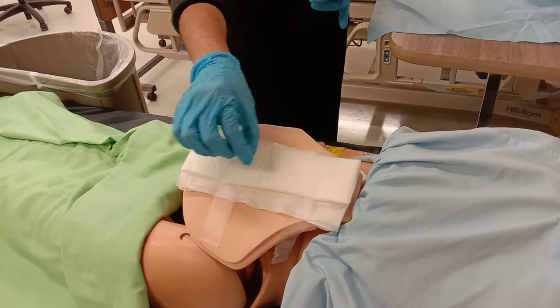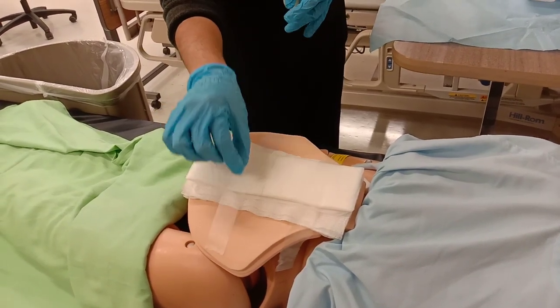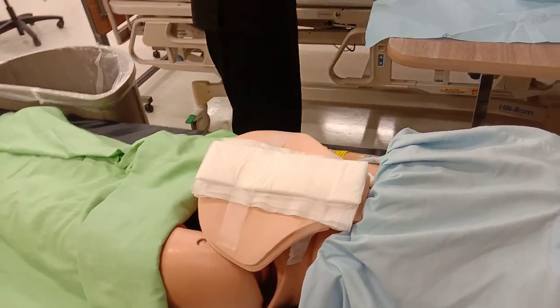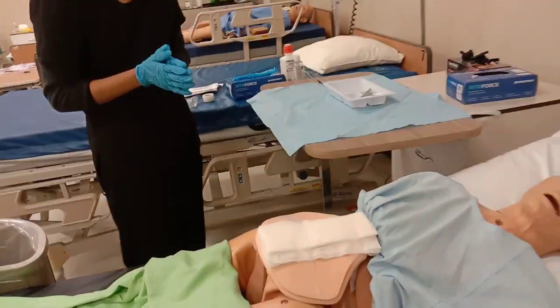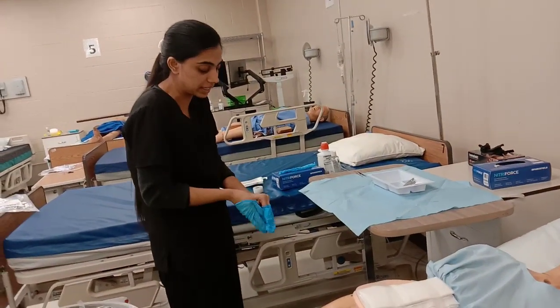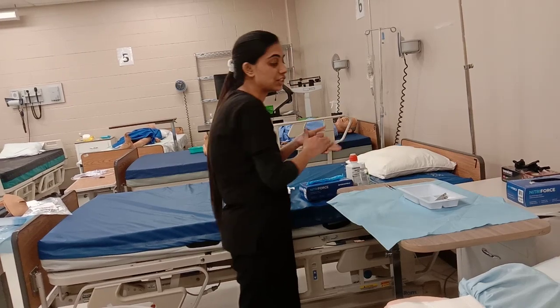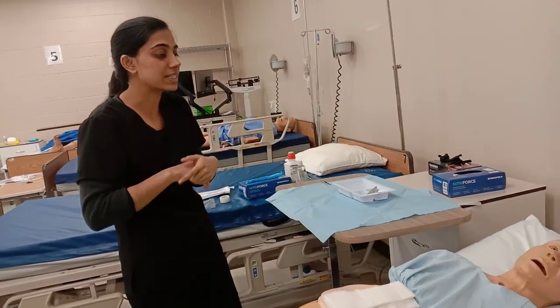Now I'm going to document my findings, like the date and time of the procedure when I did the procedure. I have written the date and time. Now I'm going to change my gloves. I'm performing the hand hygiene. Now I'm going to reassess the patient.